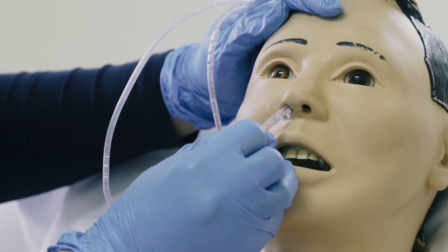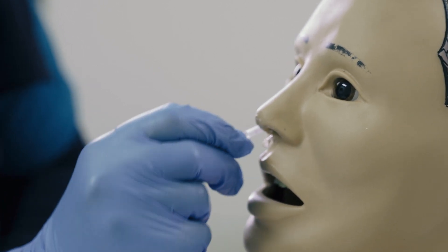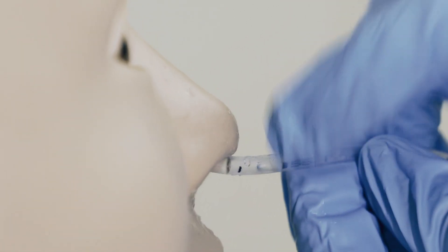The nurse will insert the tube in the selected nostril and slide it backwards and inwards. Meanwhile, ask the patient to swallow some water if possible, to aid the tube to pass smoothly until it reaches the required length.